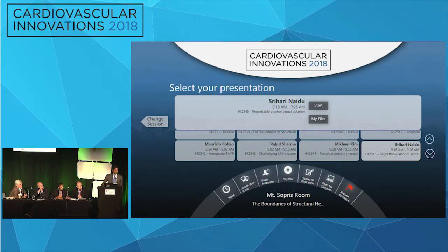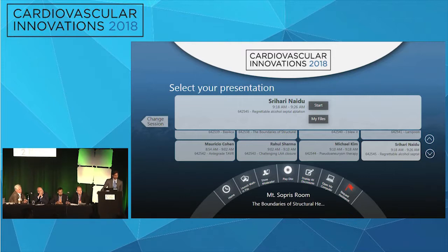Yeah. I do wonder, with your points there, if we had done subselective. Right. That first little branch may have done it, because it was thicker there. I think the mid-ventricle was thinner, and so the mid-ventricle is probably what blew. As an interventionist, we all know we can start small and always add to it later. In terms of my rule of thumb for alcohol dose, I usually say 0.8 cc per 10 millimeters of thickness. Uh-huh. So this was about that. Yeah, you're right. It was a little bit higher, but nowadays I would have done about a cc.